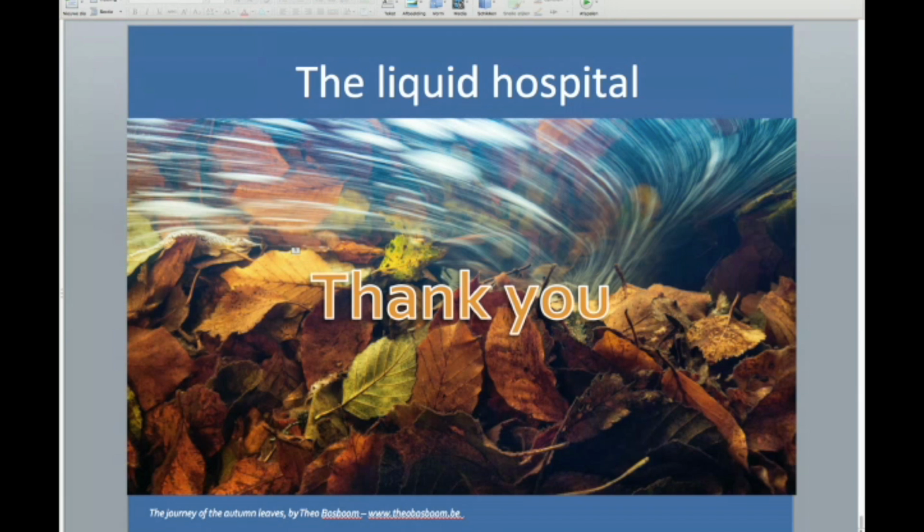Well, the reports are being sent and they are accessible in most cases, not for patients, but only for referring doctors. But there is some variation. Some hospitals also provide the reports for the patients. But yes, all the images are being sent to that server. It's not a parallel PACS, so the history is not as big as we have in our own system. It's only the latest examinations or a limited history. Not all the priors are available, but just a limited amount.